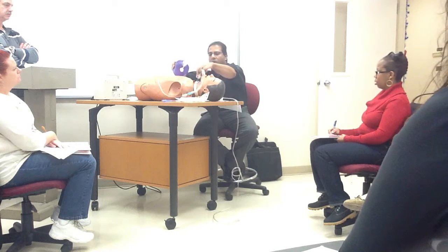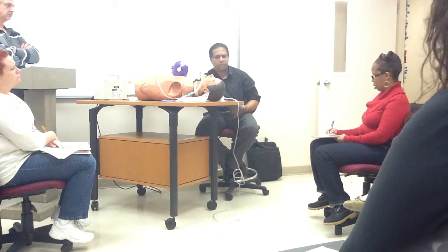Hyperoxygenate that way, for about a minute or so, 1 to 2 minutes.